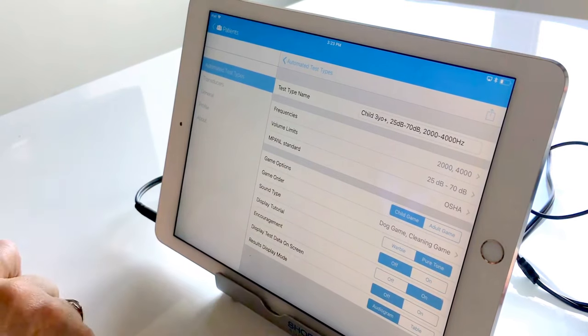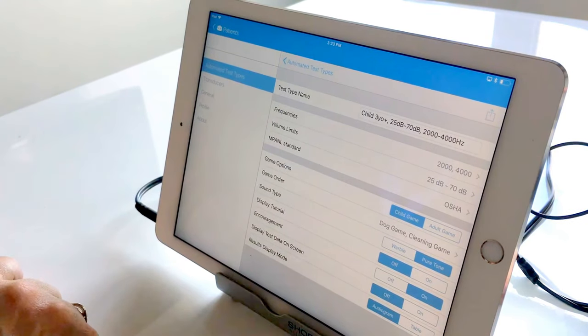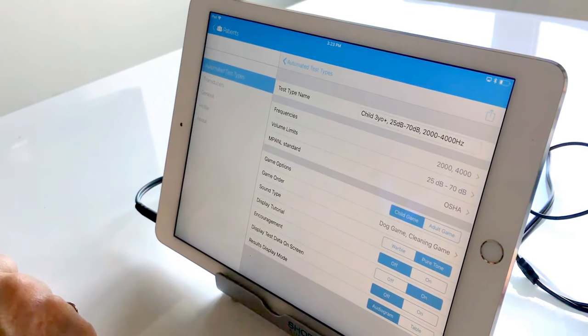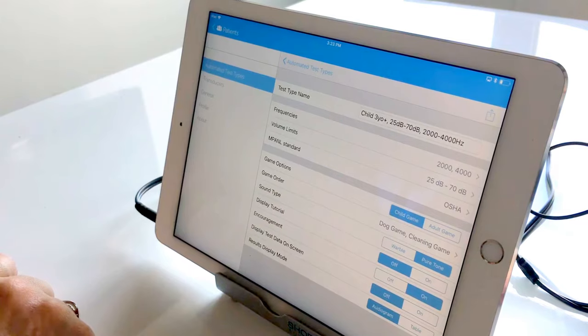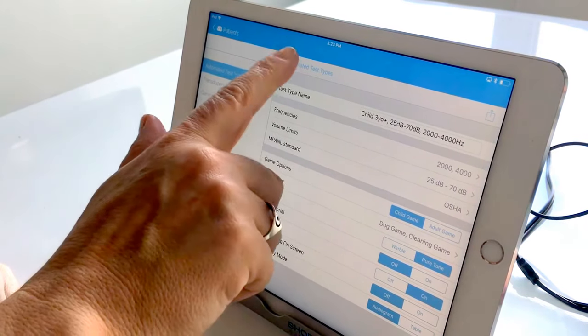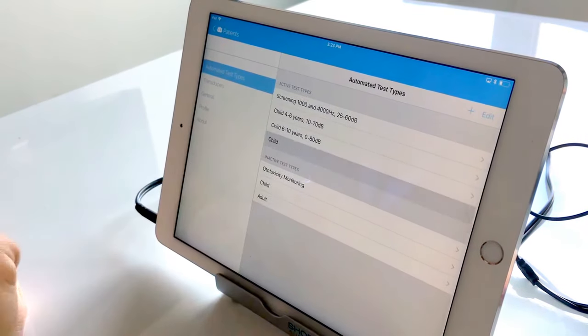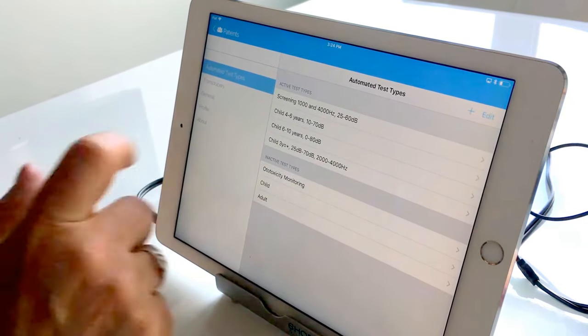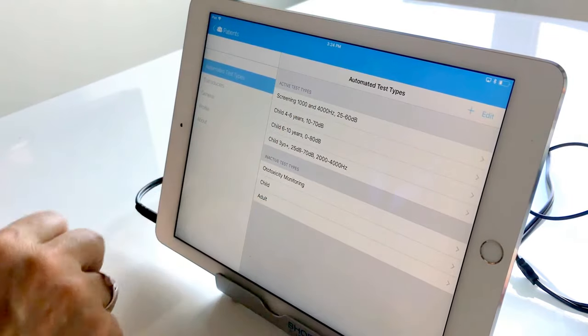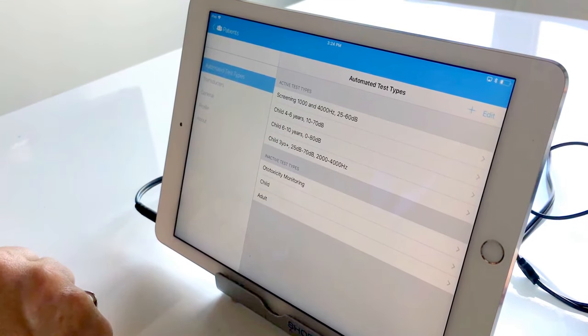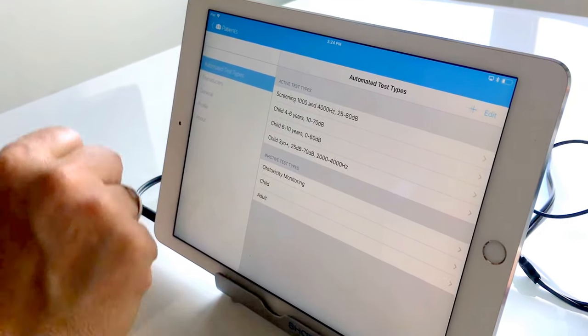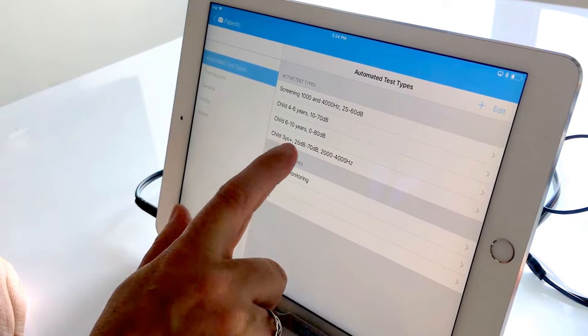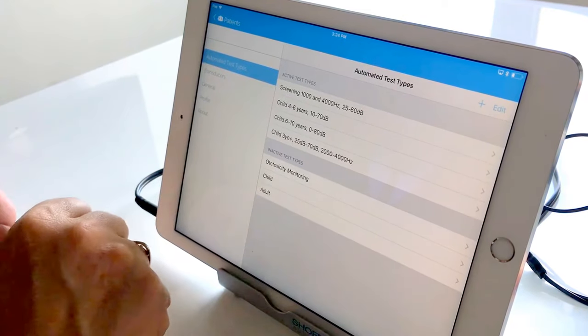So that is a run-through of some of the configurable aspects of each test type. When we go back to the automated test types we'll see now that I have four active test types. I have one for children three years old and plus.